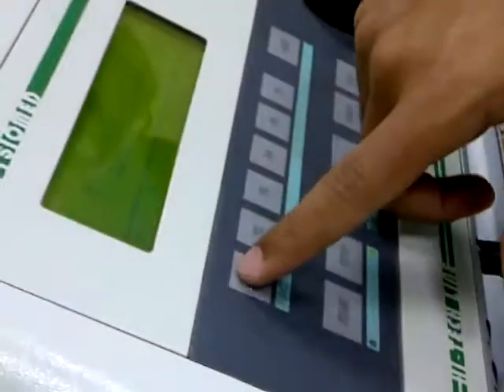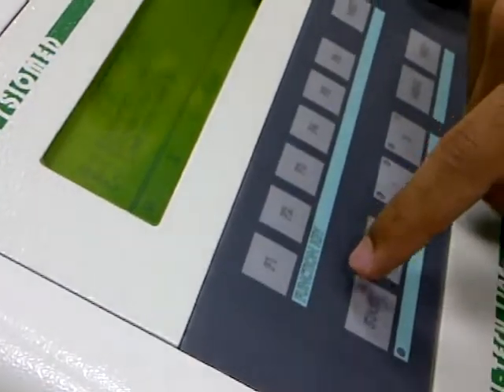Patient is acute. Set for a 1:1 ratio duty cycle, 50%, and intensity 0.5.